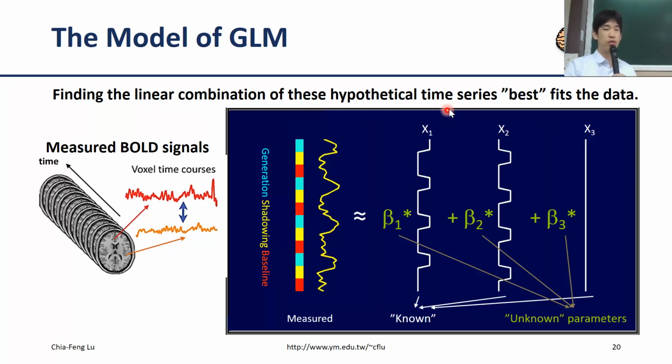Okay, so now you have condition 1, condition 2, and normally we will have another horizontal profile. Although now it's put in the vertical way, actually this is a horizontal constant profile. That means I can adjust the average or mean value between the experimental design and the measured profile. So we give one horizontal or constant profile, which we call X3. In this case, we will have these 3 regressors.